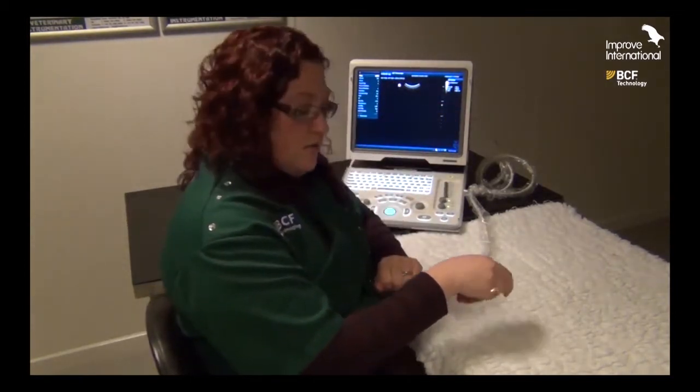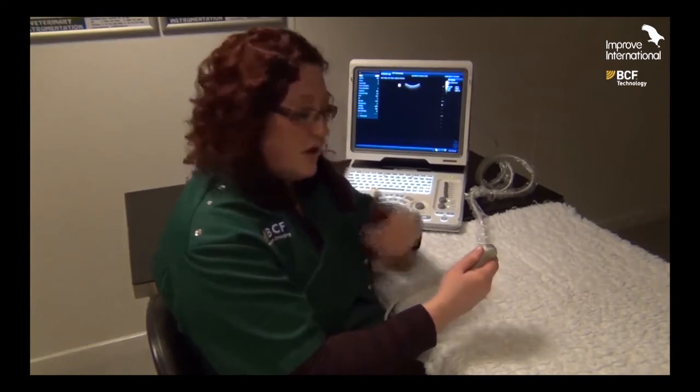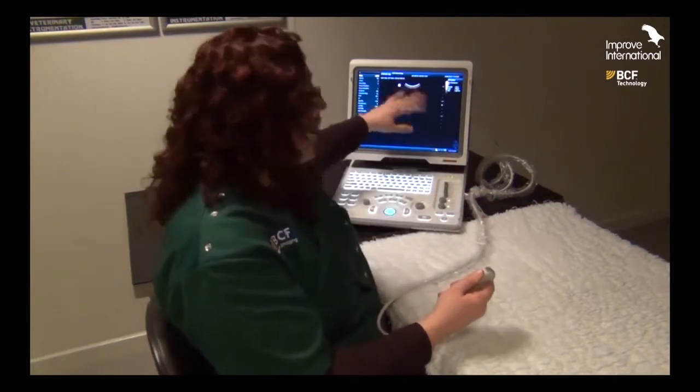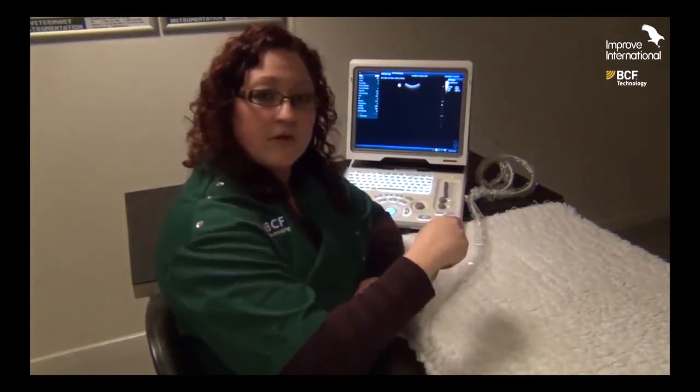We can use the thumb mark to our advantage: if we want to see more of the side of the screen near the thumb mark, we point the probe towards the thumb mark. Conversely, if we want to see more of the side away from the thumb mark, we point away from it. It doesn't matter what orientation your probe is in — for example, if the probe is rotated and we have half a kidney on one side of the screen, we should point towards or away from the thumb mark accordingly, rather than pointing towards the cat's head, which won't improve the situation.